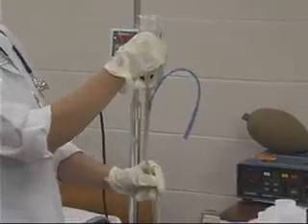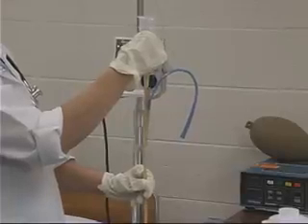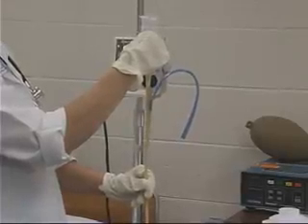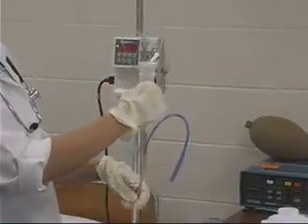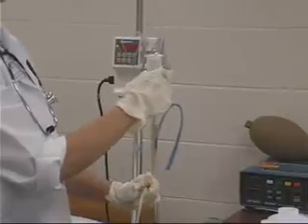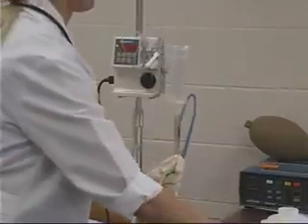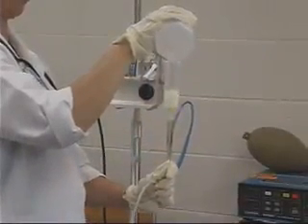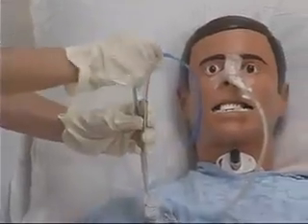Clamp the tubing before the syringe empties, or continuously refill the syringe before it completely empties. If the syringe empties and the tubing fills with air, additional formula will move this air into the client's stomach and increases the risk of vomiting. Flush the tubing with 30 cc's of water and clamp the tubing. This completes this procedure.